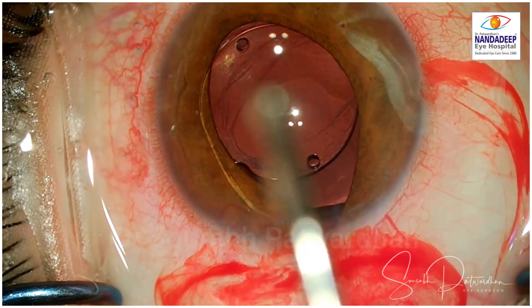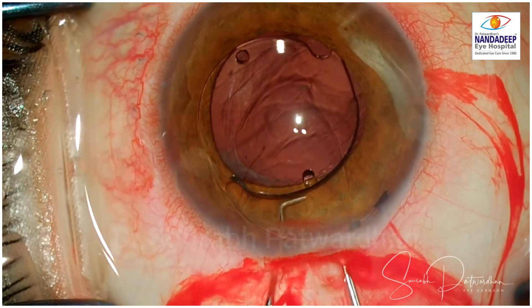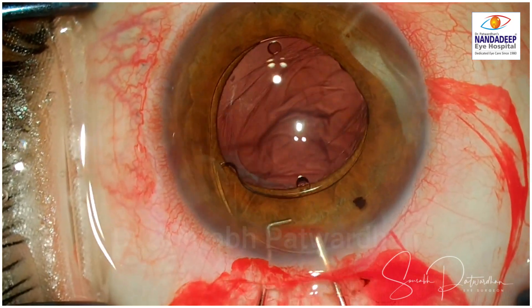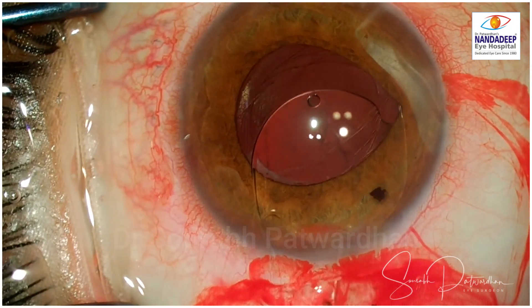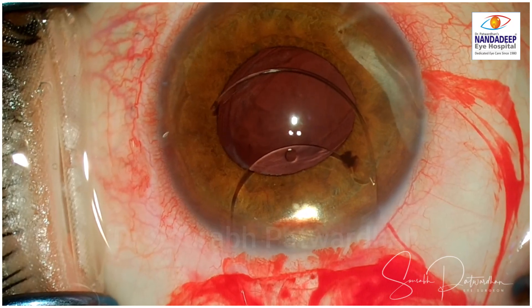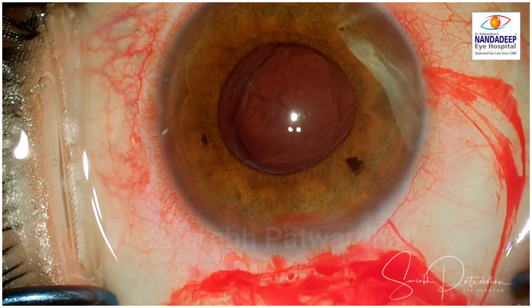Now this is the method to remove the IOL from the anterior chamber. One Sinski hook is placed underneath the IOL optic and another Sinski hook pulls the IOL out. This way you avoid it getting stuck in the incision or avoid iris incarceration while removing the IOL. This is a smooth way to remove the PMMA IOL from the eye.